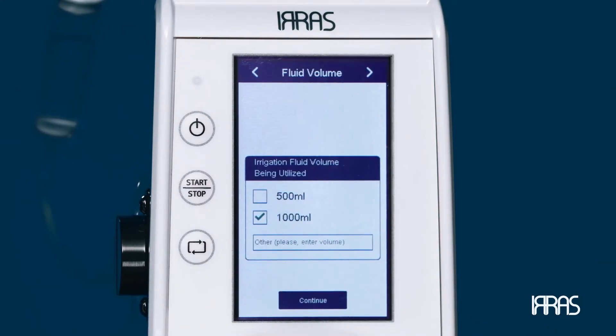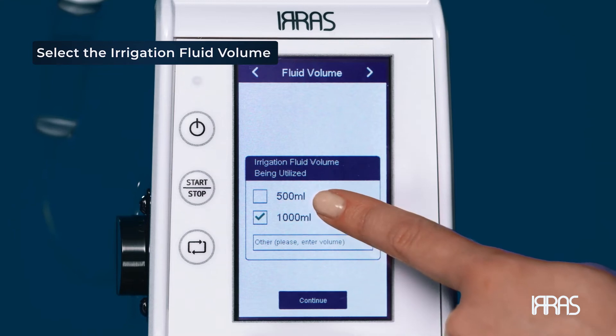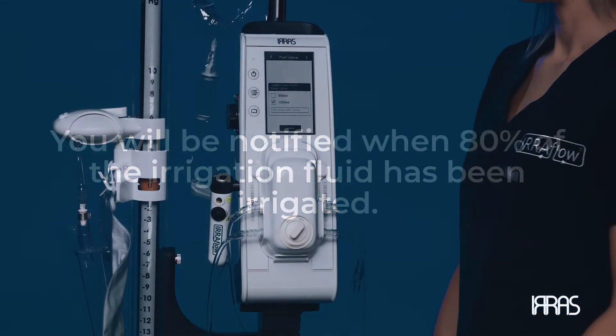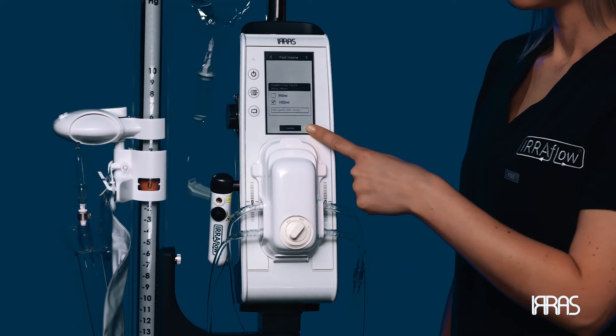It is time to select the volume of the IV bag being used for irrigation fluid. You can select 500 milliliters, one liter, or another volume to be entered. You will be notified when 80% of the irrigation fluid has been irrigated. Once the fluid volume is selected and confirmed, press the continue button on the screen.